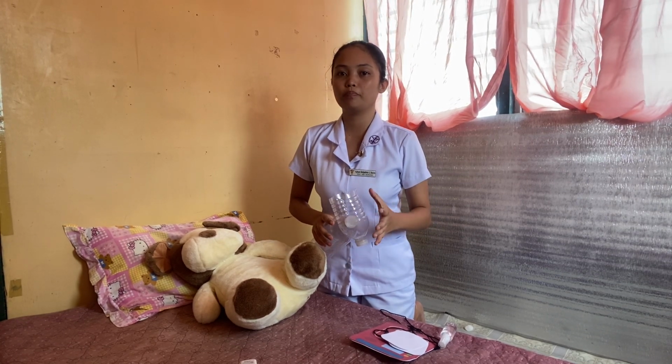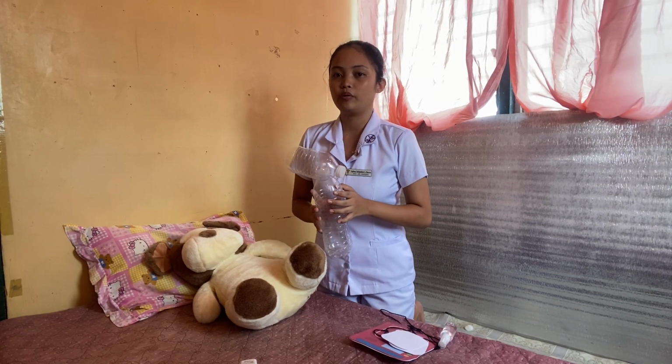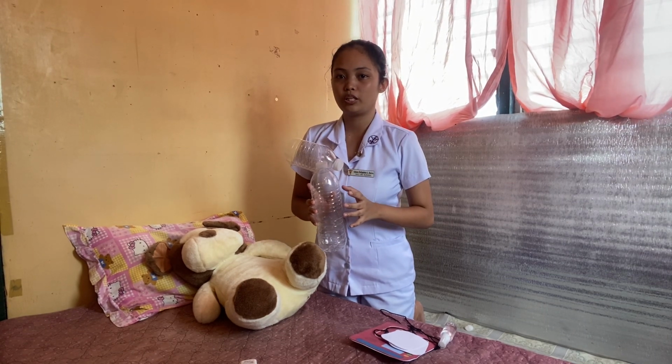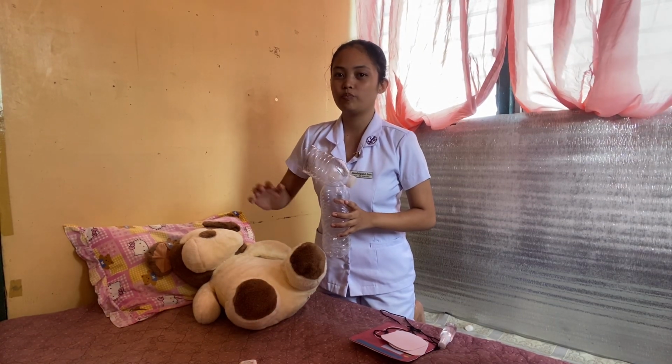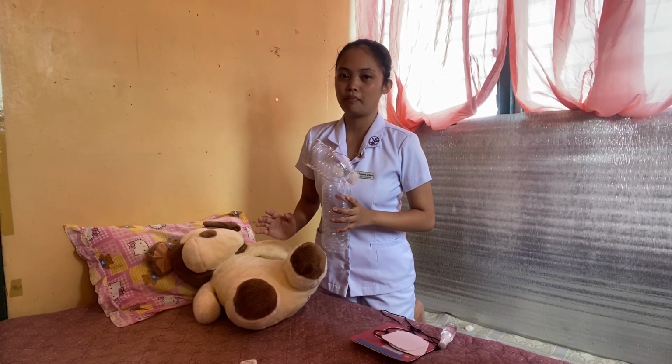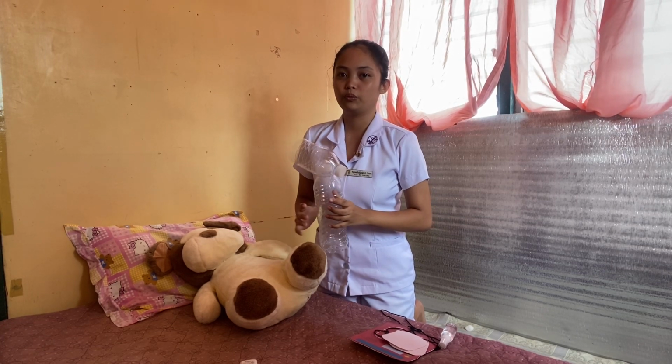Hand position would be the thumb and forefinger of one hand placed at the rim of the bag mask to ensure the pressure seal. The remaining fingers go on the jawline of the baby. The other hand is to lift the baby's chin, not compressing the baby's neck, and to support the baby's head. That will help in delivering the oxygen to the baby.